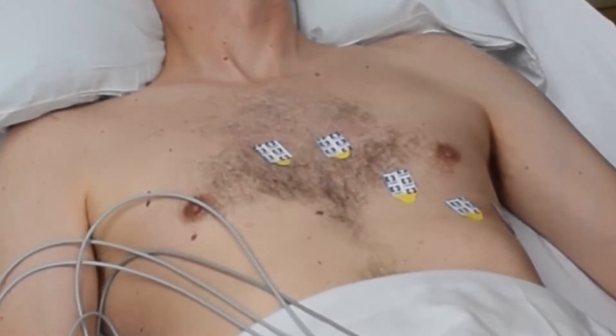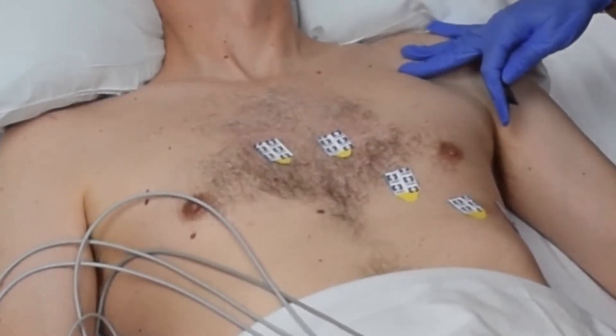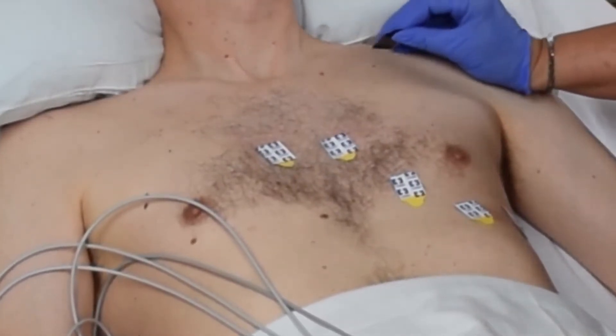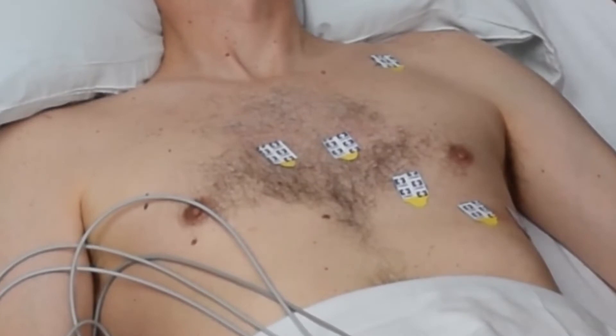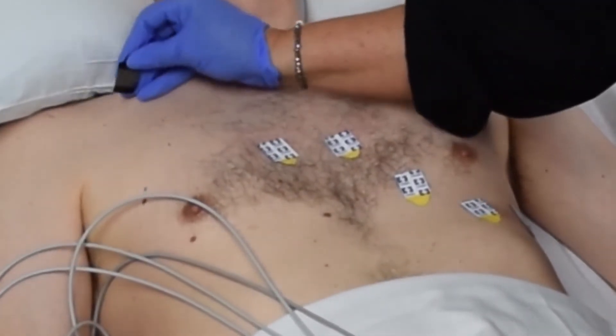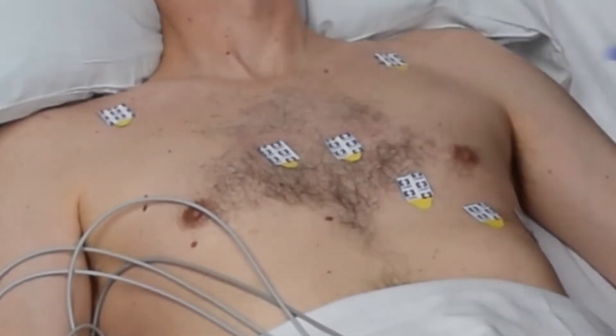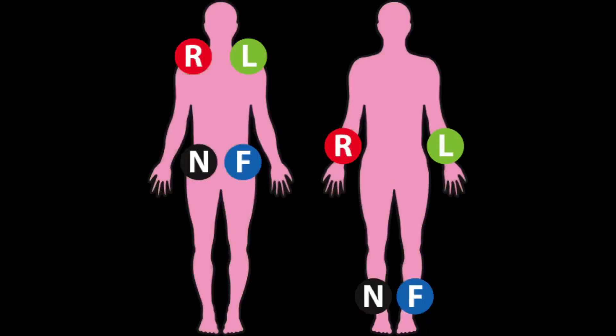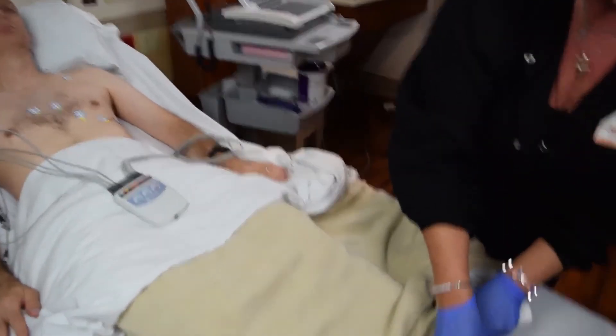Next, we will attach the limb leads. The right and left arm limb leads should be placed just below the clavicle, in the area of the shoulder. However, the leg leads can be placed anywhere below the navel, preferably at the level of the ankle, but can also be placed at the level of the hips.